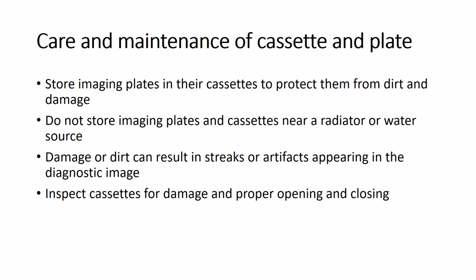First of all, you should store the imaging plate in its cassette to protect it from dirt and damage. Do not store the imaging plate and the cassette near a radiator or a water source.